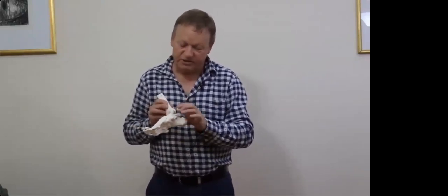So I go around very quietly and carefully and have a look for a pattern of injury that is going to be quite predictable. You are certainly going to have patients where they have multiple methods of getting rid of this kinetic energy. So they may have decided to disassociate their hindfoot from their tibia and fibula, for example. We're going to see this so commonly where their ATFL is torn, their calcaneofibular ligament is torn, and they've got a bit of degloving of the medial joint capsule from the medial side here as the deltoid ligament and the flexor retinaculum degloved from the medial malleolus.